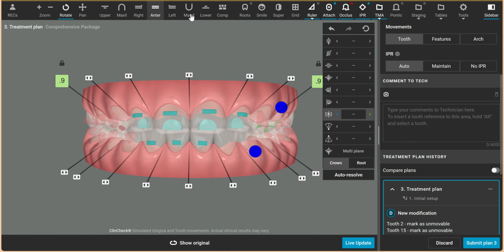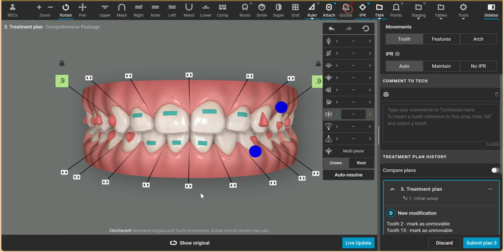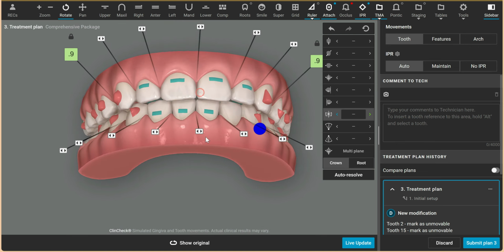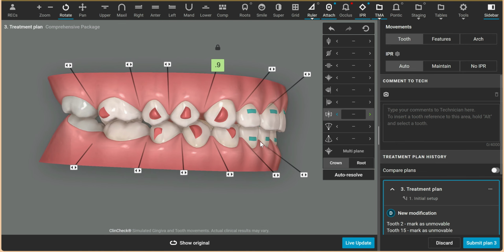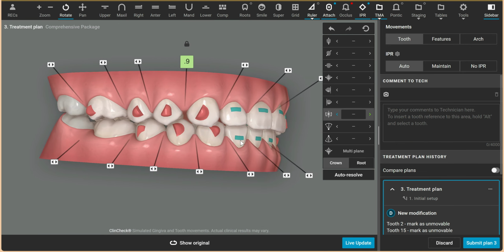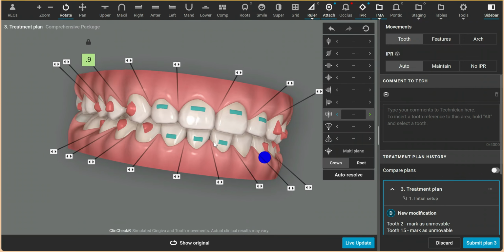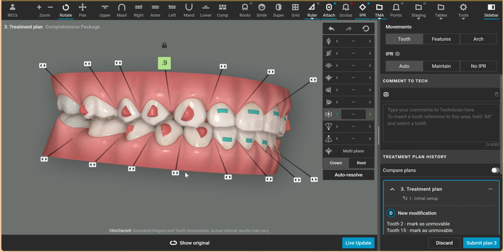Let's look at the resulting overjet after leaving that space. Well, now we have some excess right here. In fact, we have anterior open contacts, and this is what you want to see in cases where there is, like I said, a deep bite, space closure needed in the upper anterior, and also correction of lingual inclination. Is there anything else I would do with this plan?